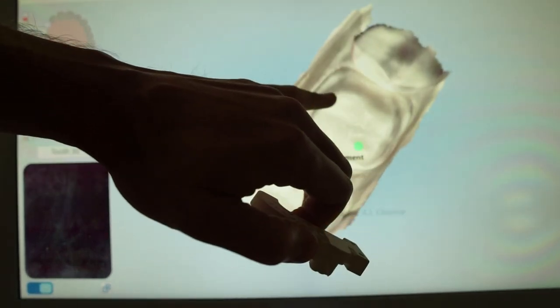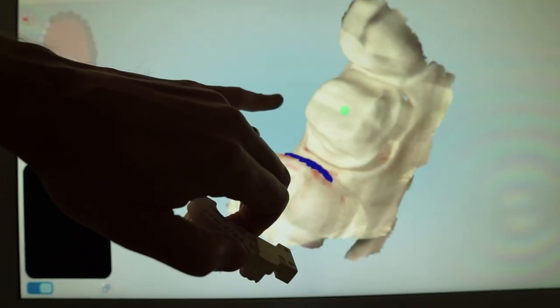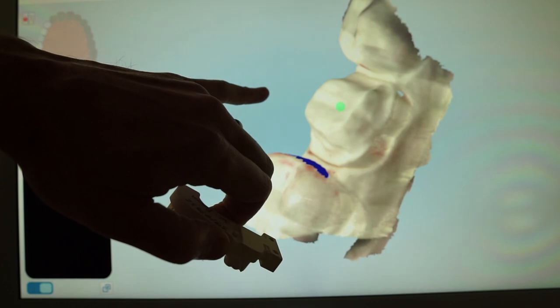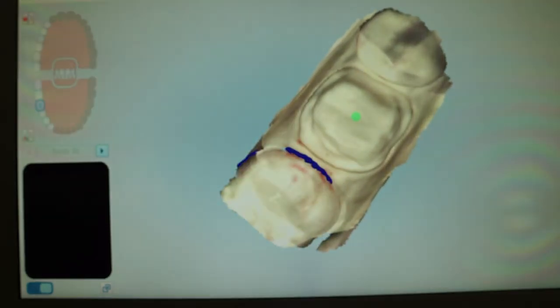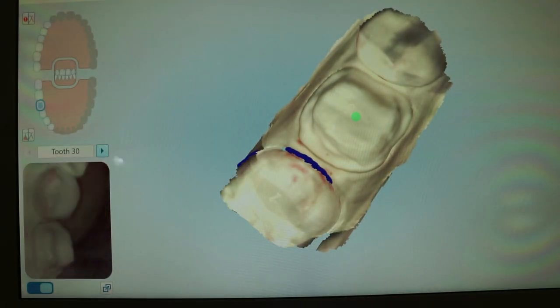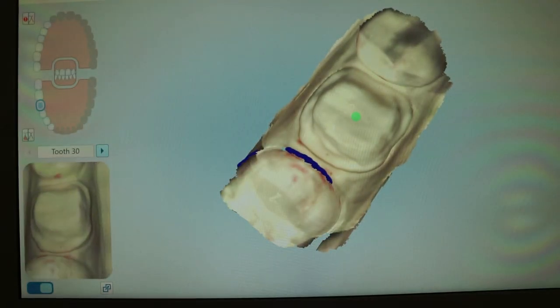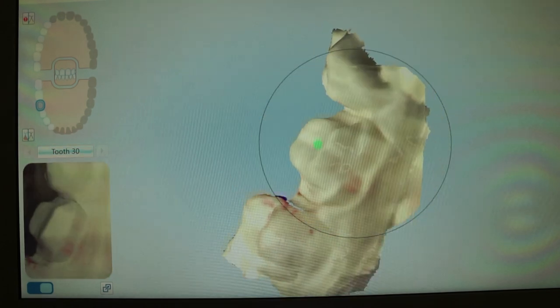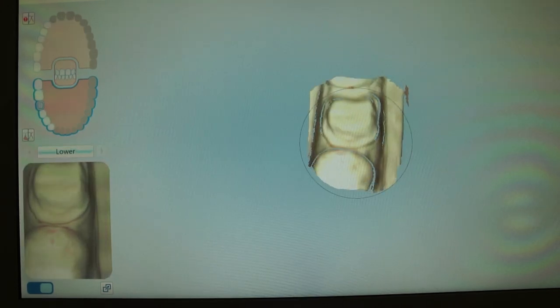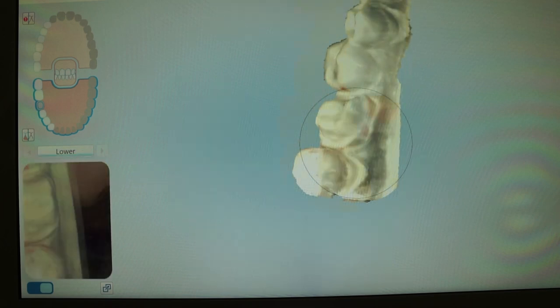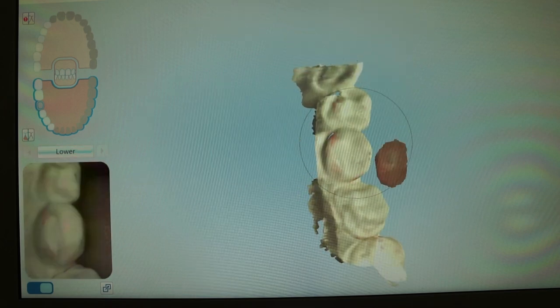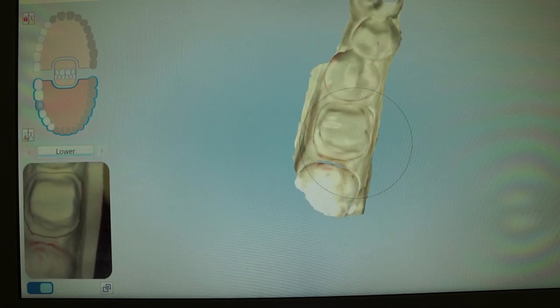You can see that green dot on top of the prep. You can click and drag that onto your prep if it's on a different tooth. But it's very important that at the end of this sequence that that green dot is on your preparation. If you have any missing data, it's good to go back and capture that.